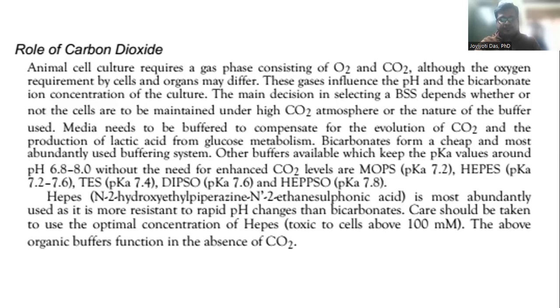So you have to constantly keep your media supplied with enough carbon dioxide so that the buffer range of the media stays around 7.4, which is again the physiological pH.